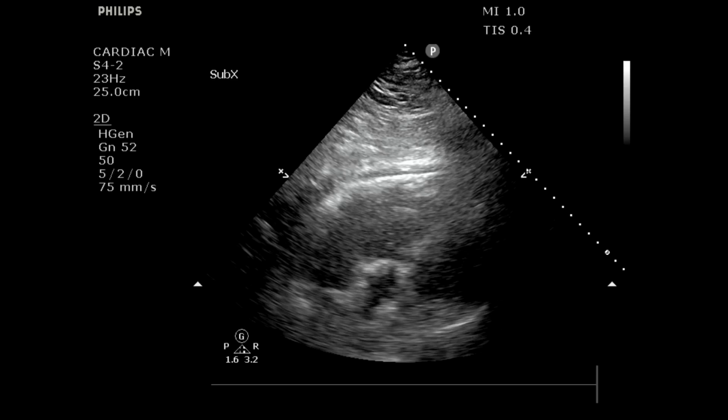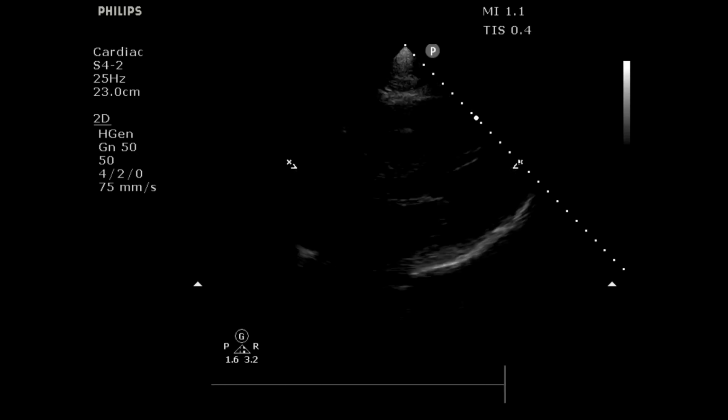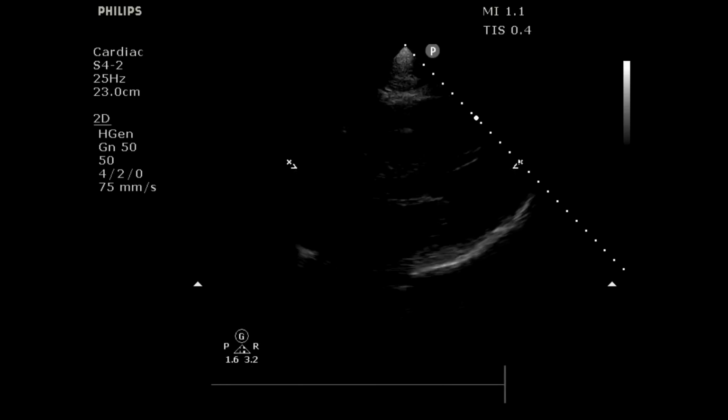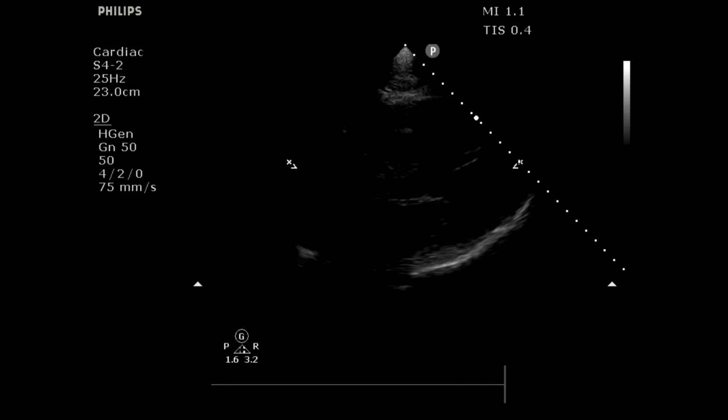Compare that with this patient, where you can see there's some quivering of the heart. We'll go back and show that again. This patient's got VFib, right? This patient needs to be shocked. That's a totally different scenario than what we just talked about with the PEA. So this patient needs to be shocked, and if you can get them back, they probably need to go to the lab to look for the coronary lesion that caused the ventricular arrest, right?